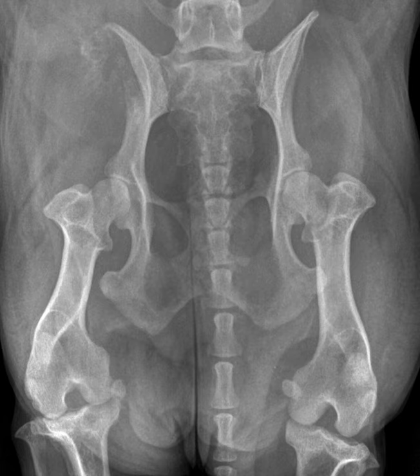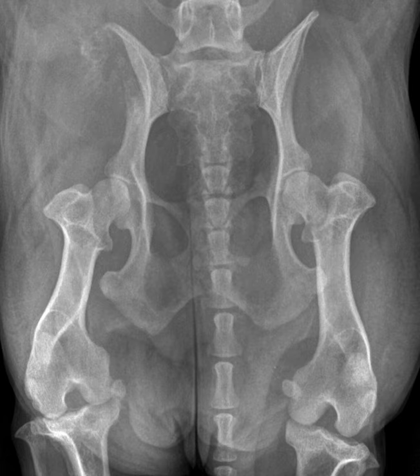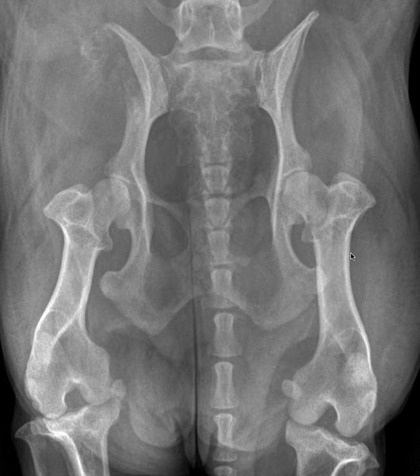Please pause the video or go back if you'd like to look at the radiographs further, and I'll go ahead and highlight some of my findings for B, for bone, in this case. My approach to orthopedic cases is to trace all the bones on all the views. I like to look at the cortex, the medulla, the endosteal surface on the inside, and the periosteal surface on the outside.